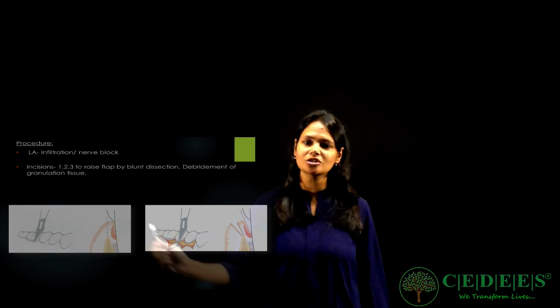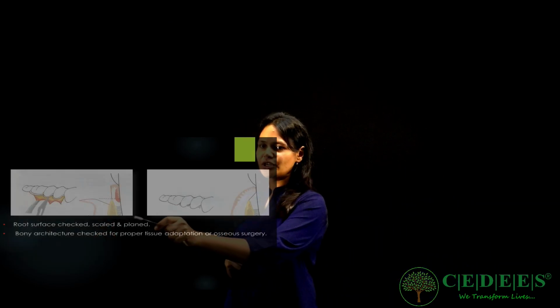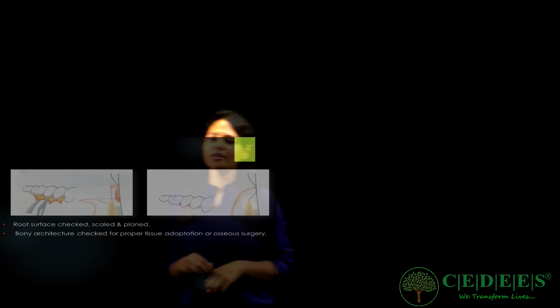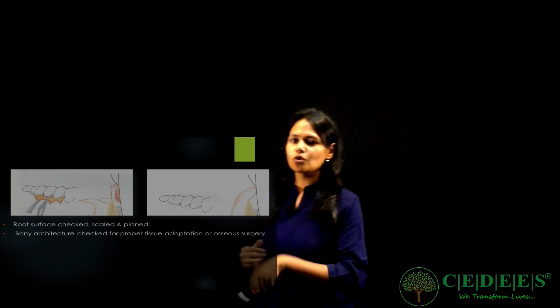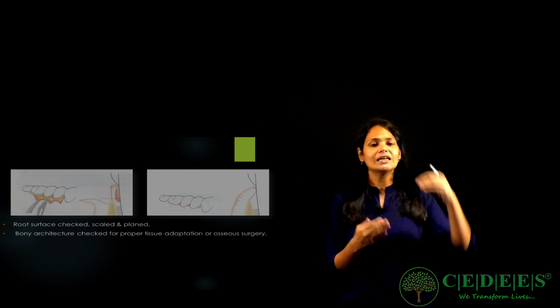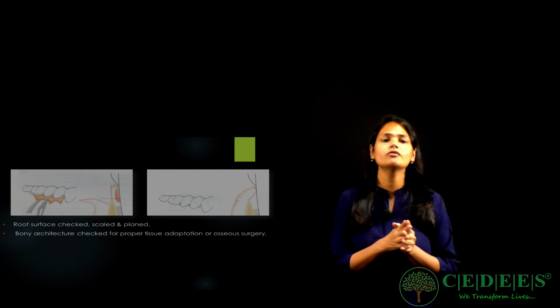So first we give the first incision, then we give the second incision. Once that is done, you give the third incision and remove this. Can you see this dotted line here? Remove this triangular wedge of tissue. Here, this small thin lining, which is the most infected part of the gingiva, is removed by the third incision, which is generally given using an Orban's knife. And then you close it, put it back, suture it up. So that's the essence of modified Widman flap. You give the first incision, flap reflection, second incision, third incision, debridement, close it up. So that's your modified Widman flap.